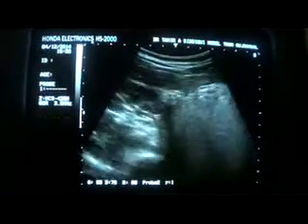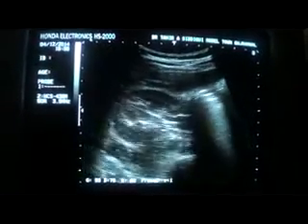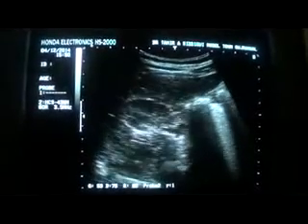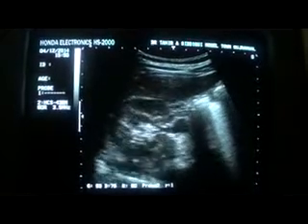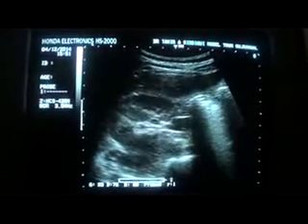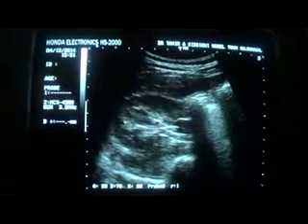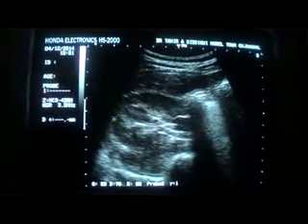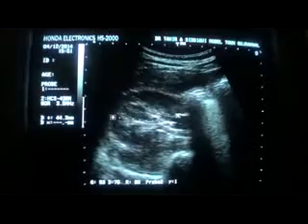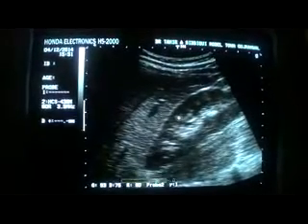Now turn the kidney toward 90 degrees, you will get the hilar region and study the hilar region. You can see vessels, patency of the vessels. This is the hilar region, this is the transverse section of the right kidney. It measures 4.4, which is within normal, and thus this is a normal study.